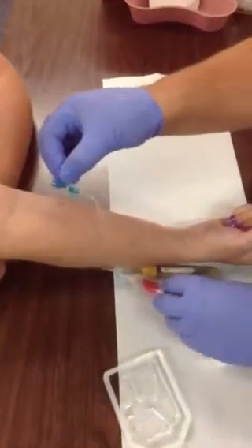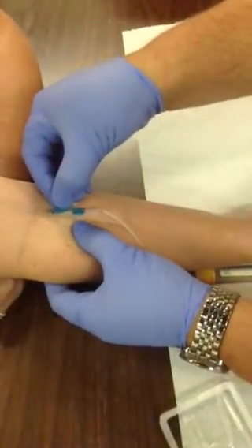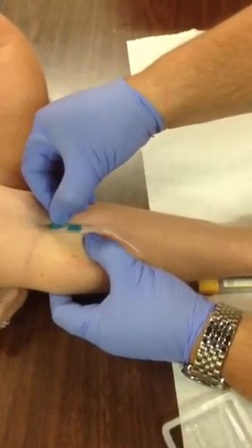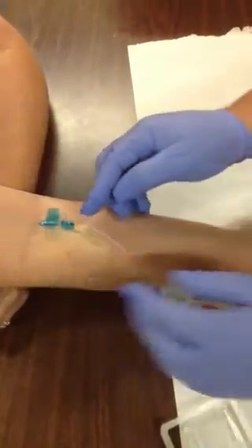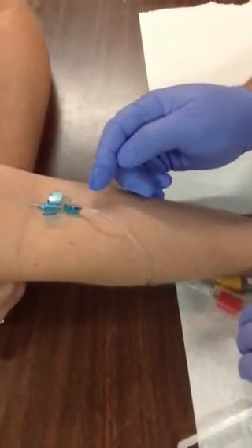We're going to approach the vein. Remember, much like an airplane approaches a runway, we're going to approach the vein. Pull the skin back tight. Warn the patient: 'You're going to feel a stick in one, two, three.' And just drop it in. You'll see a nice flash of blood right here on the tubing, which tells you you're in the vessel.